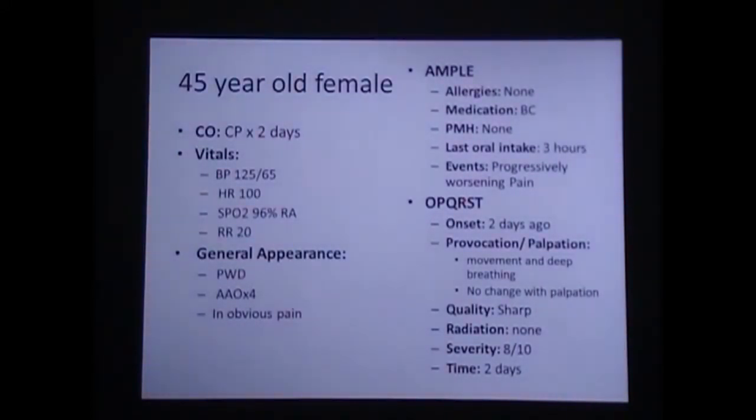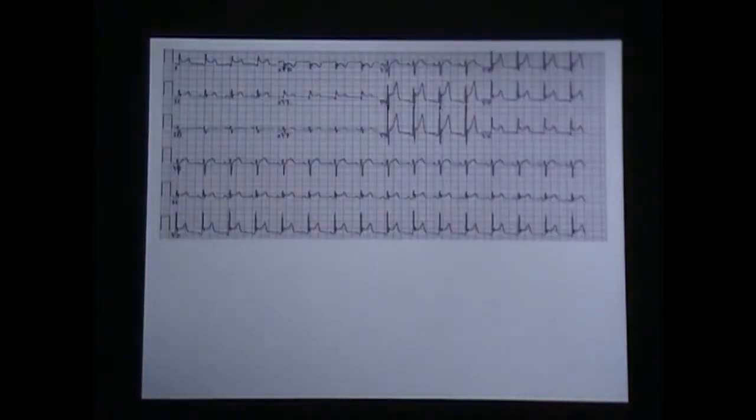So based on this picture, just talking before we ever get to EKG, what's kind of going through your mind as a differential? Probably the PE, because of birth control, older female. Yeah. Good job. Pain with movement, deep breathing, blood pressure good, elevated heart rate. That's just from the pain she's in. The sharp pain. Yeah, I think that's a good clinical assessment of things that I'm going to have as a differential. Now look at the 12 lead.